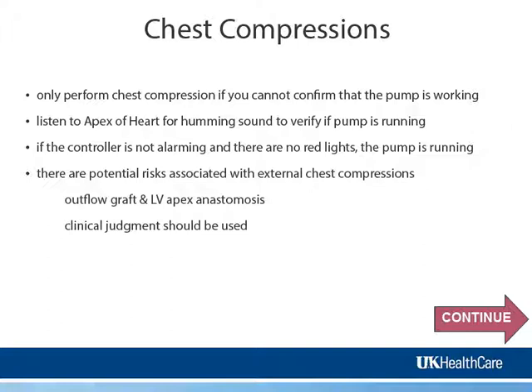There may be risks associated with performing external chest compressions in the event of cardiac arrest, due to the location of the outflow graft and the presence of ventricular apical anastomosis. Performing external chest compressions may result in disruption of the aortic anastomosis, or dislodgement of the LVAD inflow tract. Clinical judgment should be used when deciding whether or not to perform external chest compressions.